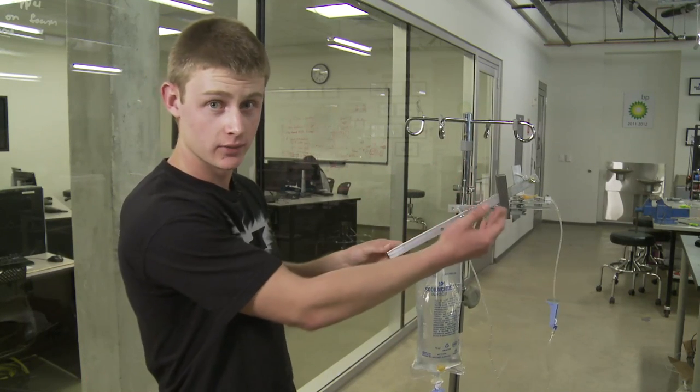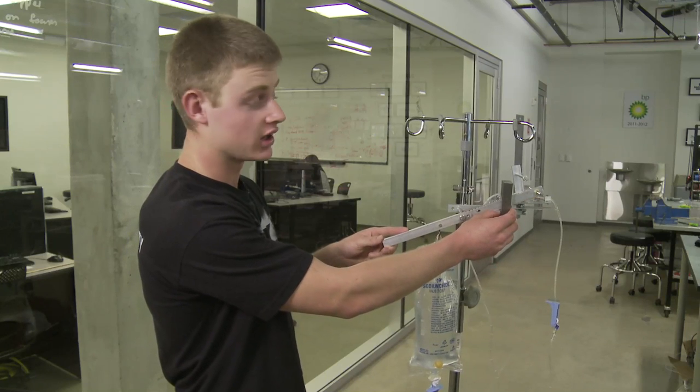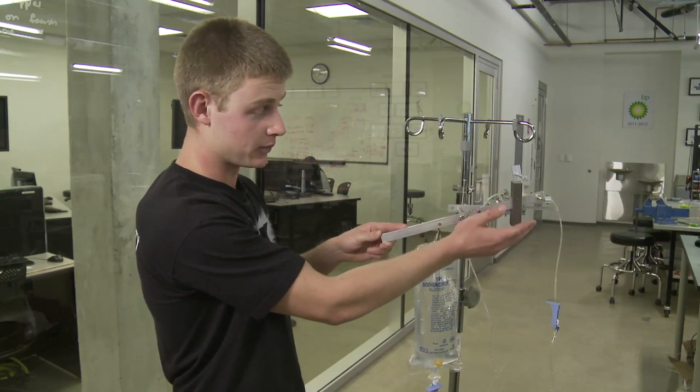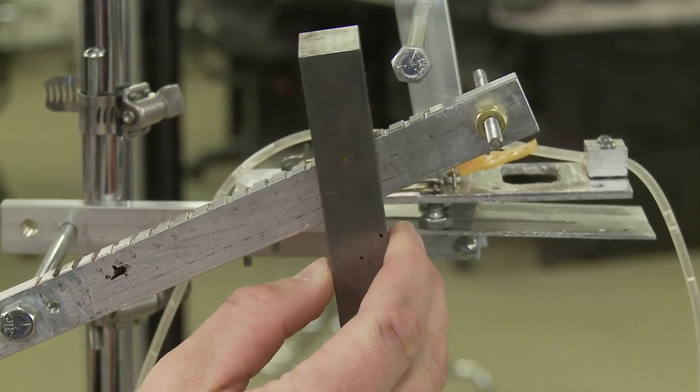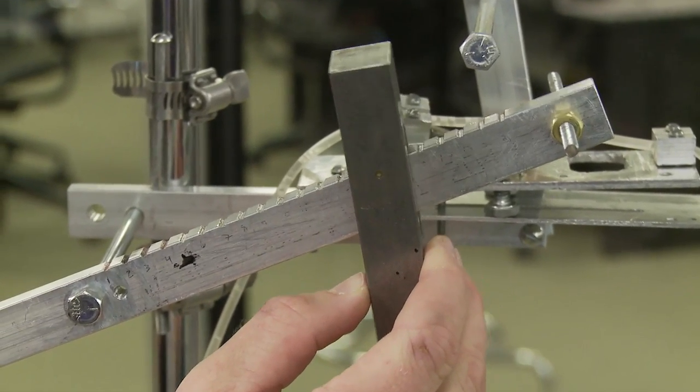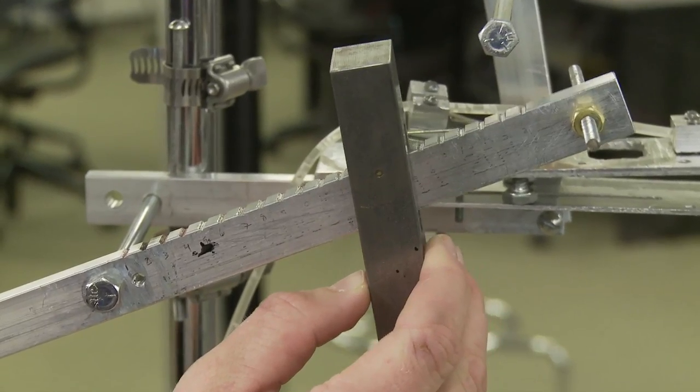Then they would set the scale. They do this by taking the counterweight and moving it outwards until they find the point at which the scale just barely balances, then they move the counterweight one notch inwards for every 50 milliliters they'd like to dispense. So that was three notches, 150 milliliters.